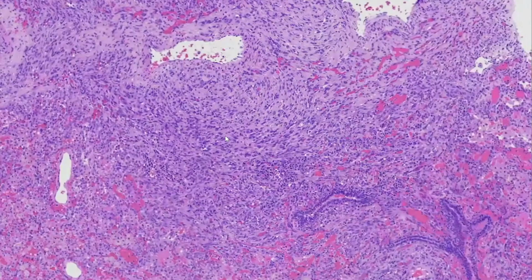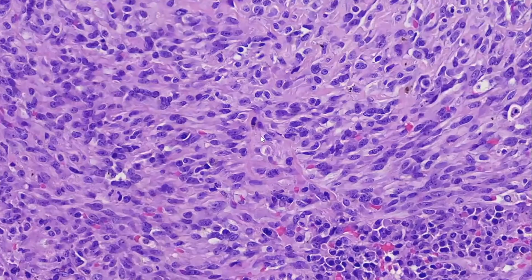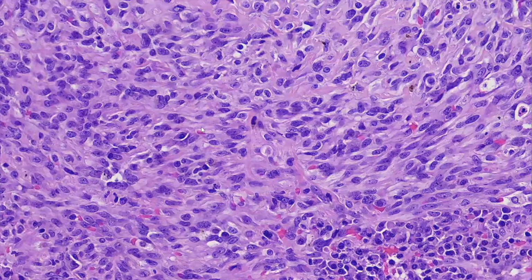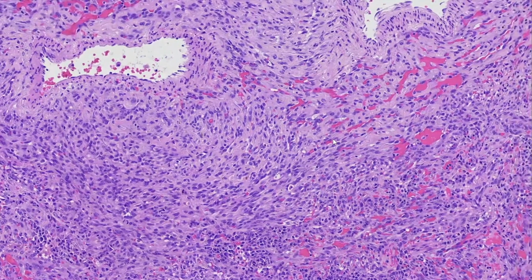And then when we go down to higher power, we can see that it's a spindle cell proliferation. And it's the proliferation of these relatively bland cells. We do note that there's relatively prominent ectatic vasculature associated with this lesion, as well as we see that some of the cells actually have intracytoplasmic lumina, as well as we see a number of extravasated red blood cells throughout. And so this should clue into your mind that this could be a vascular lesion.